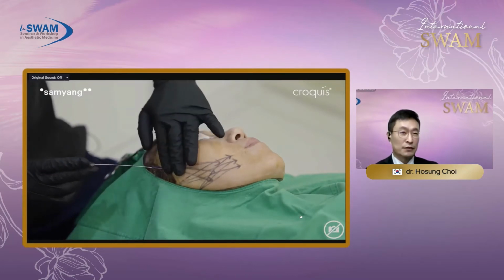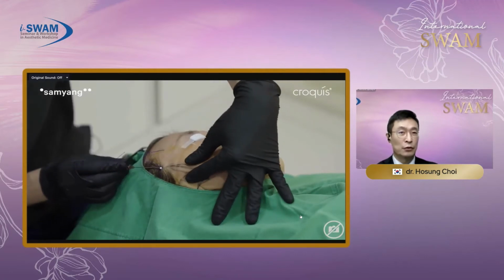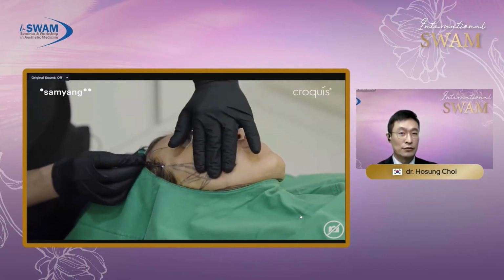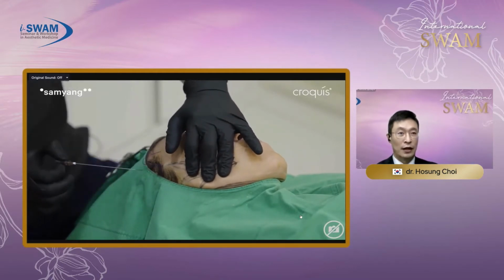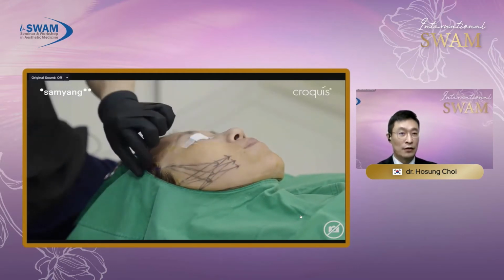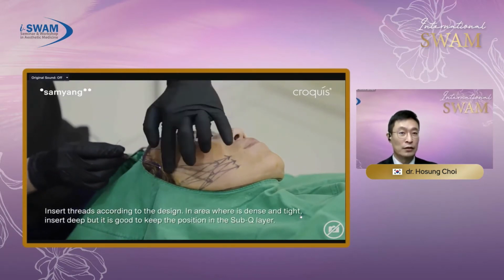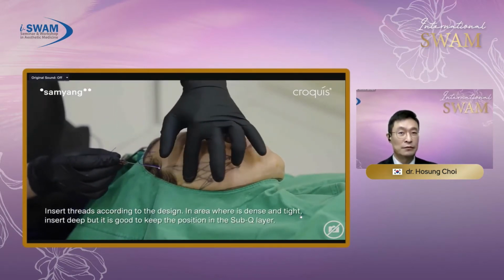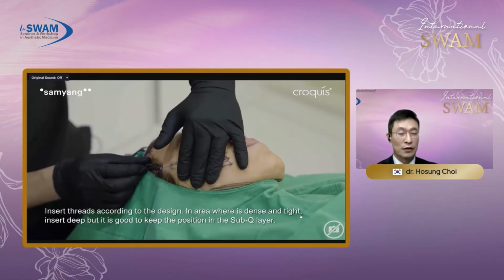Since it's difficult to retrieve once a thread is inserted, it's important to locate the thread at the right depth from the beginning, and always use the other hand, non-dominant hand, for supporting the insertion and checking the depth of the cannula during the advancement of the cannula.